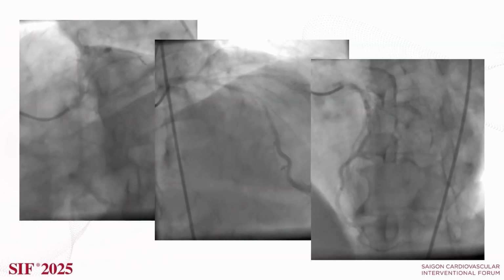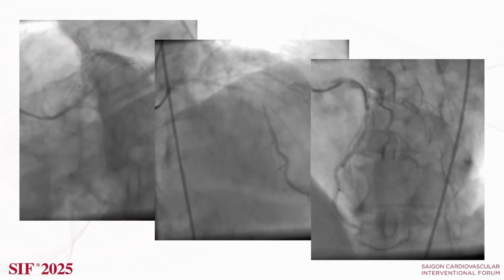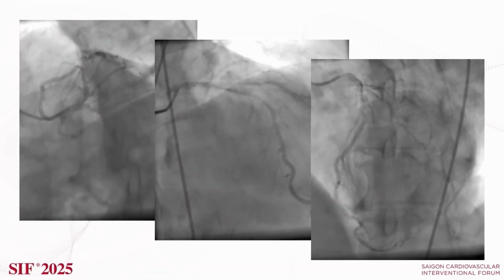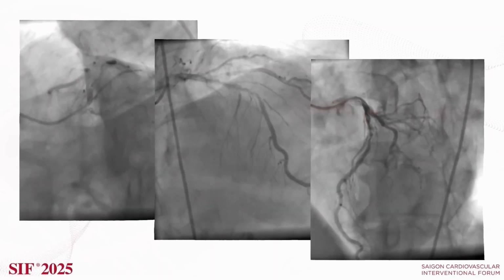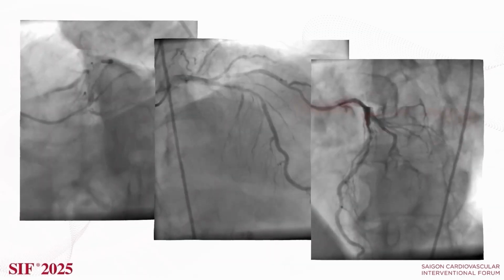So in this case, do you do a stepwise PCI, or do you try to prepare for every PCI procedure? I guess once you start working on the left main, you're kind of committed to do something there. So I think we have to figure out what's going on at the circ ostium, whether it needs treatment as well. I sort of presume that the right is going to be large, isn't it? Because the circumflex is fairly small.